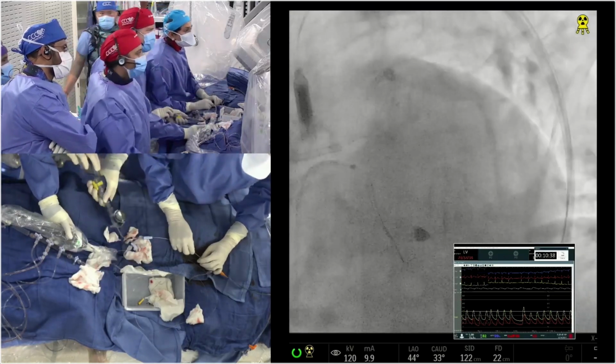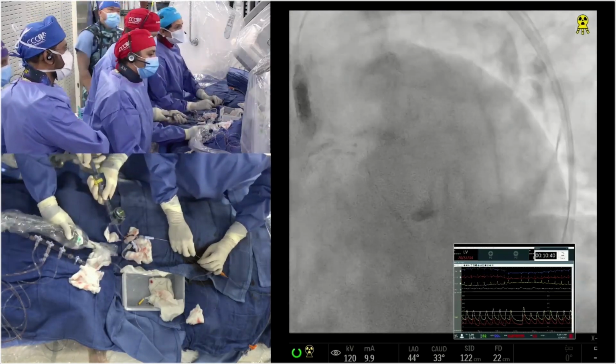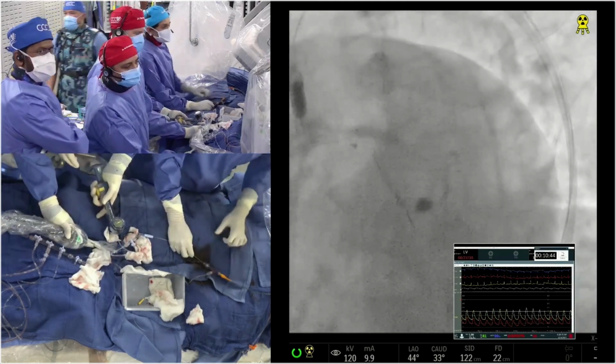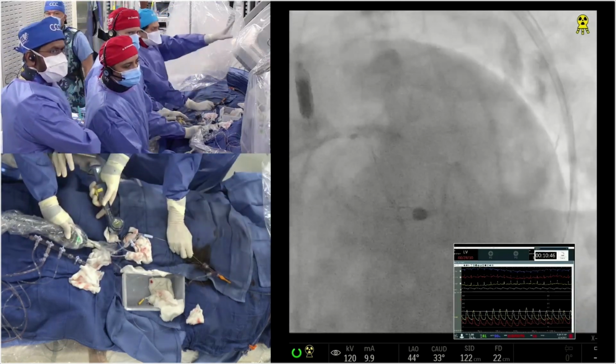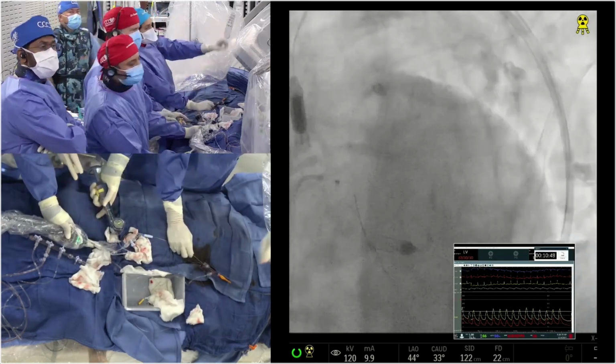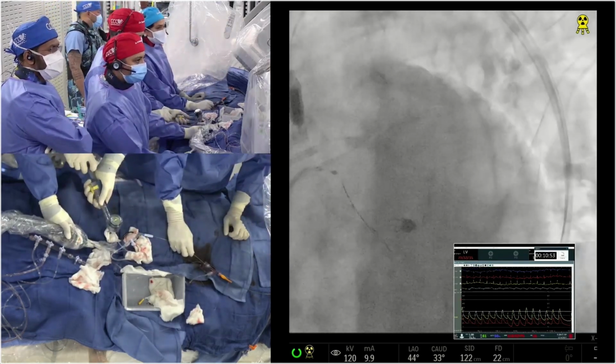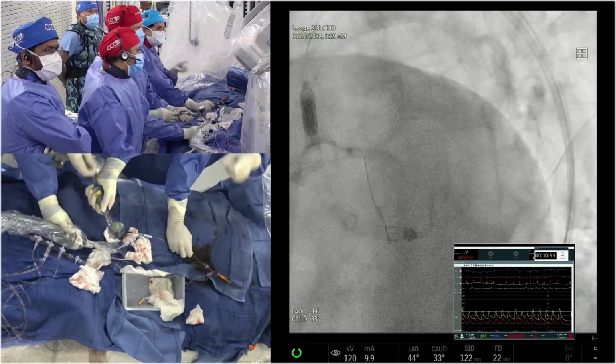Complete in 5 minutes. Okay, copy here. Yeah, we'll be done. So SS is saying go to the other side. Okay. Yeah, but after we complete the case. No, so tell us what your plan is. We'll be done. Hold on. I want to show you the IVUS of the circumflex, and then we do 2 stent. At that time, you can go there. He's waiting for you.